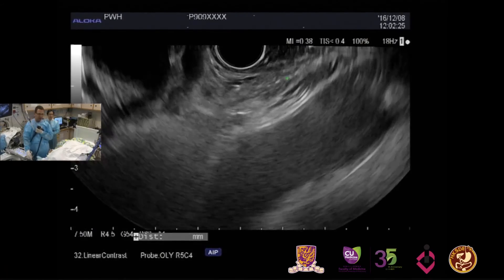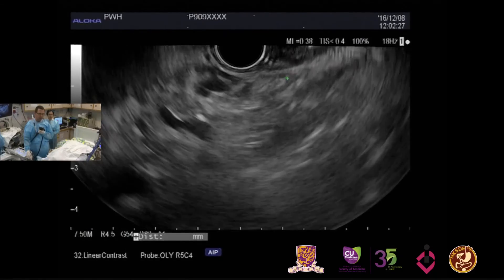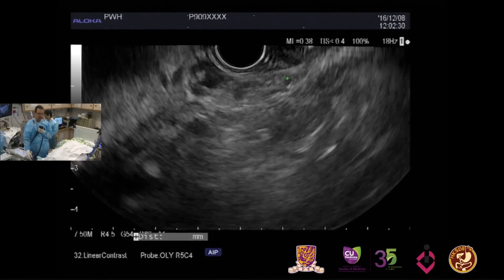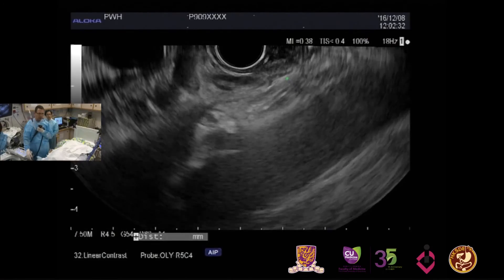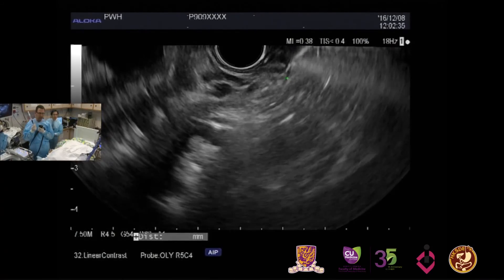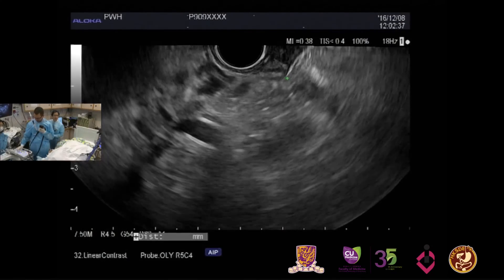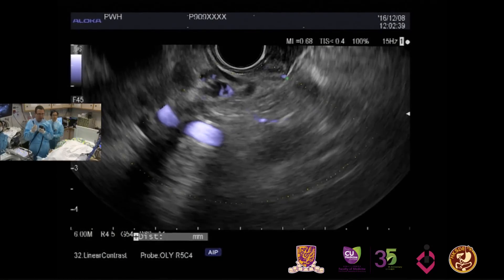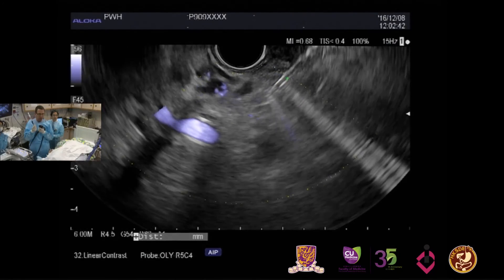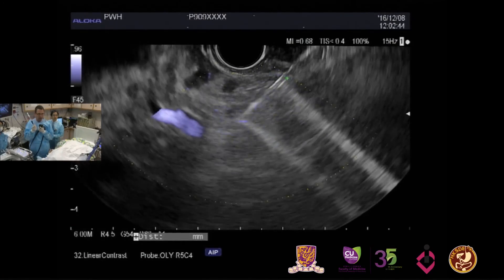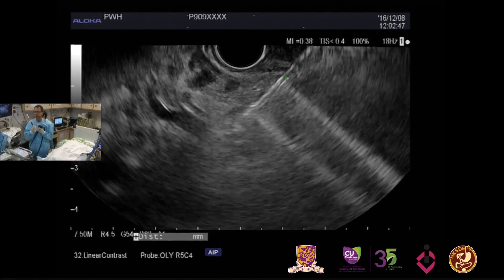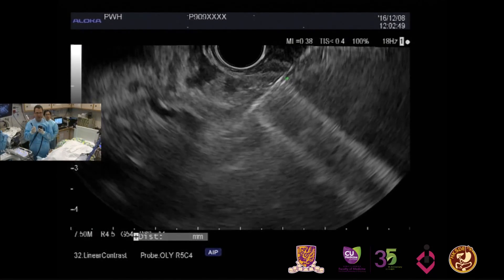Now I'm preparing for the injection on the other side. I rotate a little counter-clockwise to go just off the axis of the aorta, bring the needle into the field of view, check the Doppler, and adjust the angle. Thank you for the demonstration.